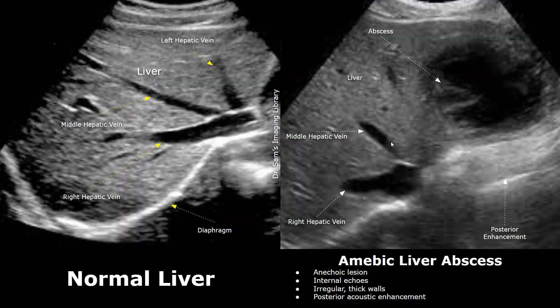Here is another case of a liver abscess. It is mostly anechoic and has internal echoes and thick irregular walls. Posterior acoustic enhancement is present. It had no internal vascularity on color Doppler. This was an amoebic liver abscess.